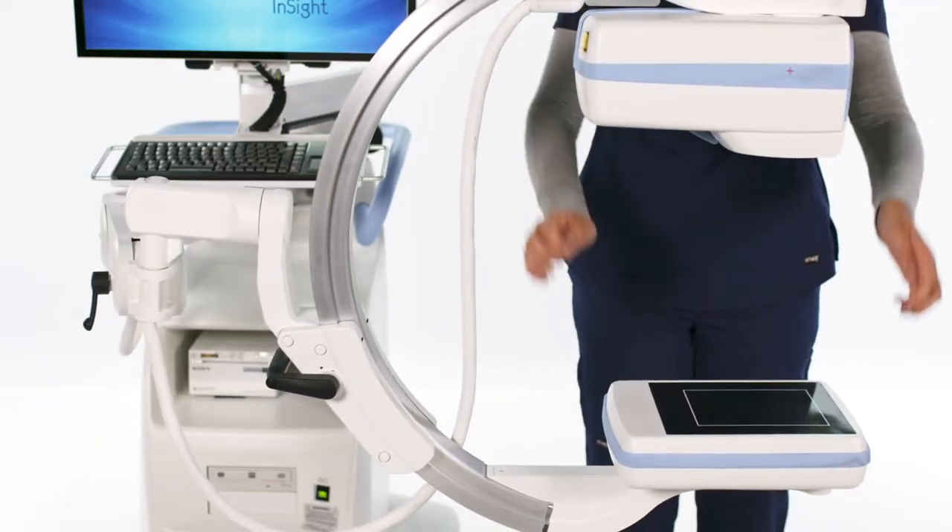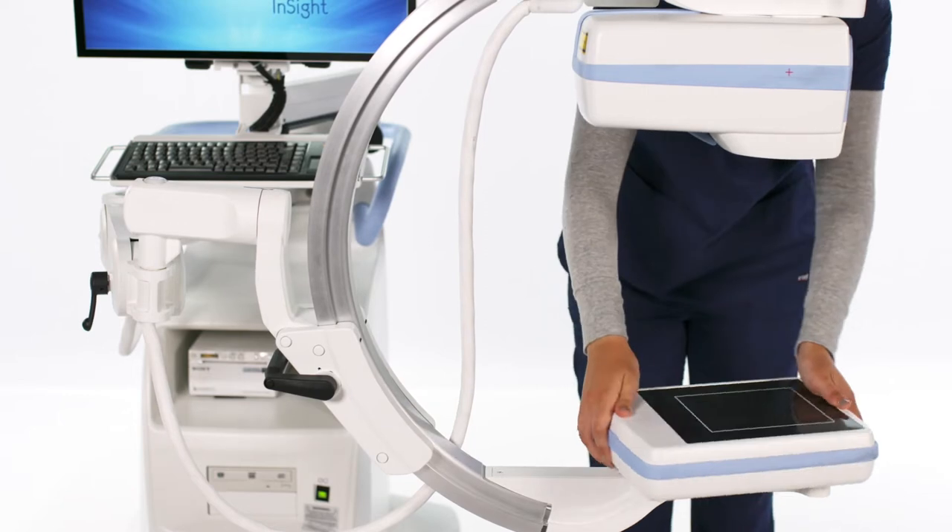The detector, located here, can be rotated 90 degrees both ways.